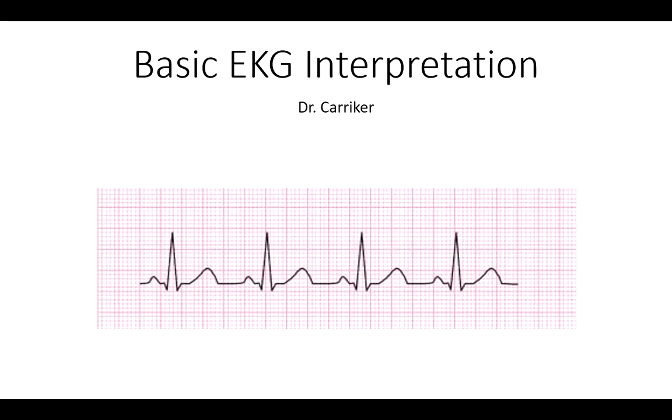In this lecture, we'll be discussing basic EKG interpretation, and with that in mind, I want everybody to keep in mind this is certainly not all-encompassing and not including all material that could be learned about EKG. These are just the basics and some of the interesting things that you might see or note or find when observing an EKG rhythm strip.